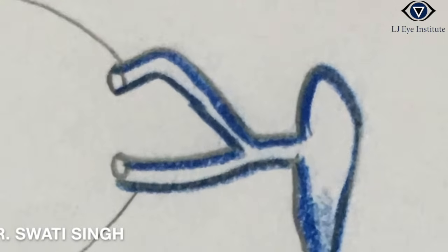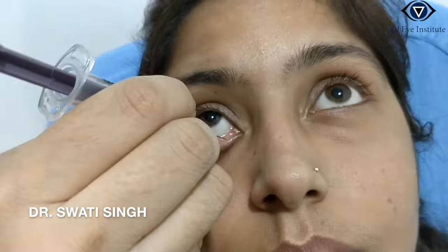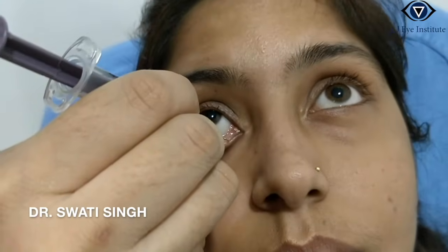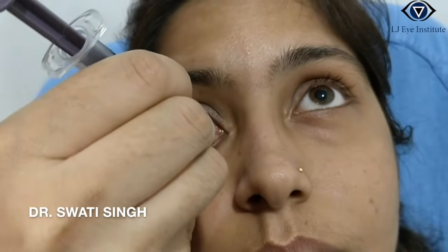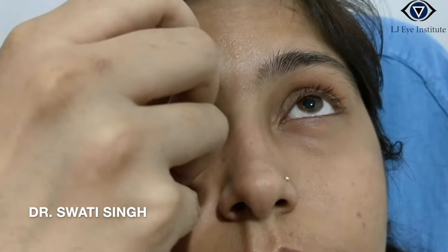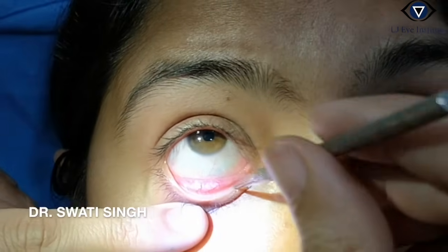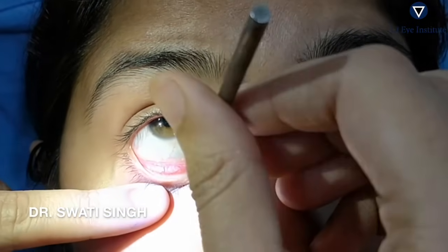The lacrimal cannula mounted on the saline-filled syringe is first introduced vertically and then turned horizontally, parallel to the lid margin. In cases with a small punctum, a punctum dilator is used prior to syringing.